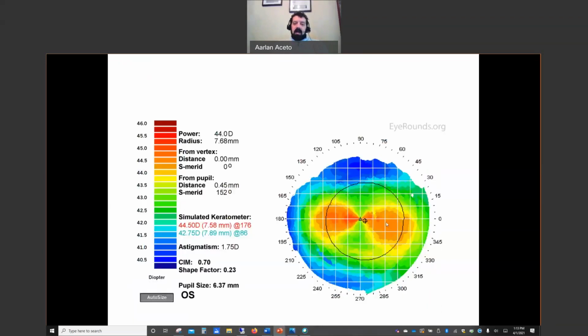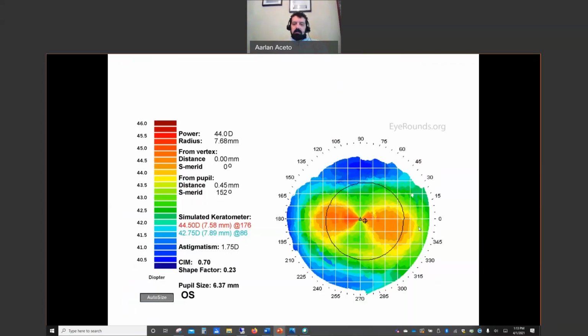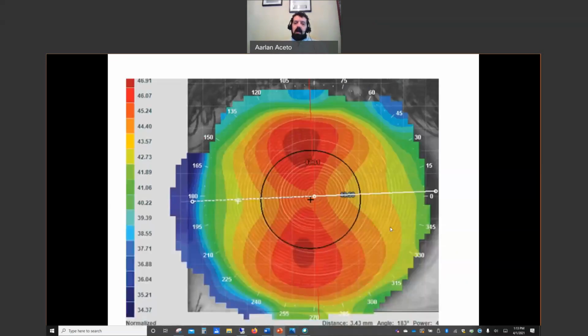This looks like a bow tie if you were to look at a tie, and this looks like a regular tie. Well, if it's a regular tie, it's with the rule, and if it's a bow tie, they're little weirdos once in a while, so that would be an against the rule. If you're having trouble, just remember, side to side, bow tie, against the rule; up and down would be with the rule, and obviously if it was curved at a 45 or 135 angle, that would be an oblique.